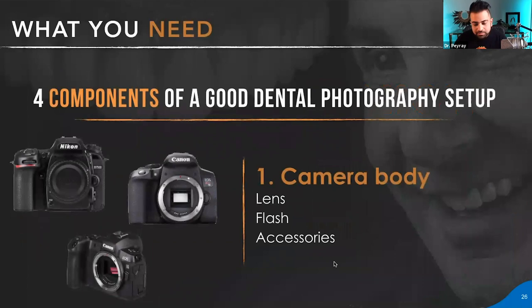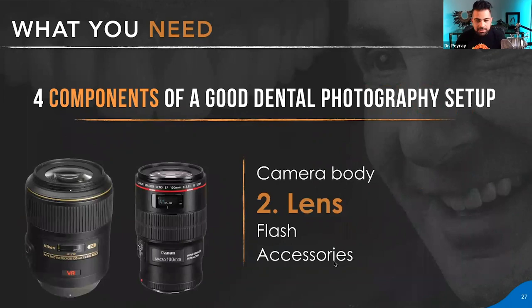Now, the second component of good dental photography is the lens. So we talked about the camera body, and now we talk about the lens. The body, again, full frame is cool. Then you need the DSLR. Honestly, I don't like mirrorless right now. I feel like I haven't played with them as much, but based on doing so much research, the DSLR works so much better. Mirrorless is not there yet.